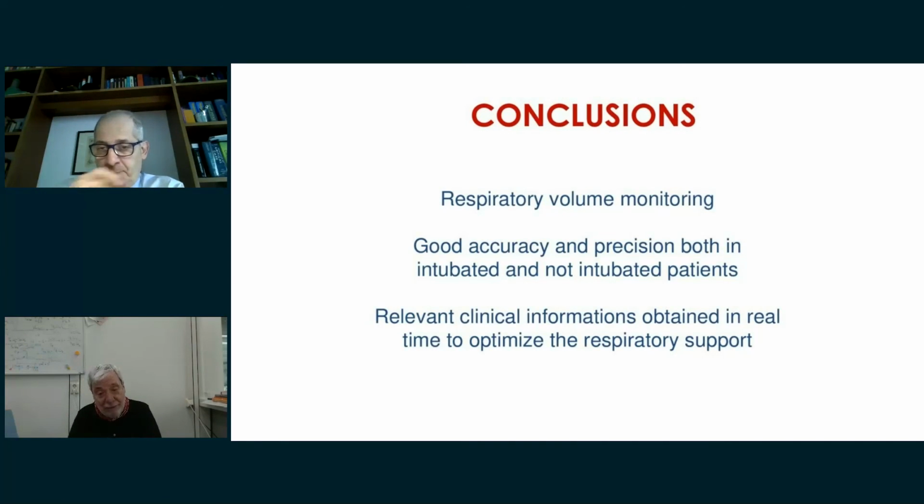For the inspiratory effort, you have to look at the motor, and the motor is how much negative pressure you produce in spontaneous breathing. Remember the slides in which I put the contraction of the muscles, and so on. I think it's important to understand what we are talking about, in which part of the field we are. So once again, measure.